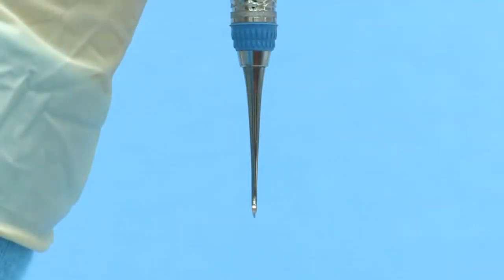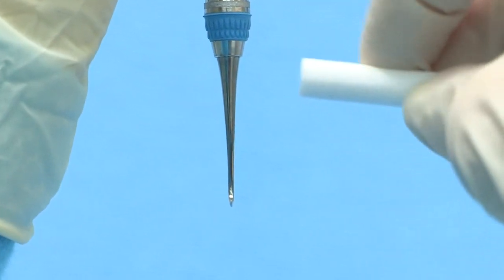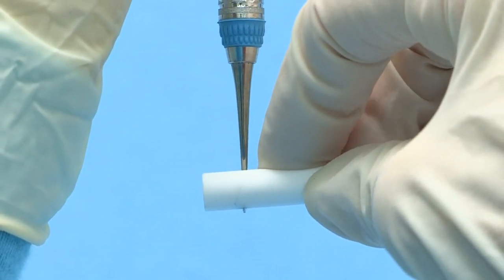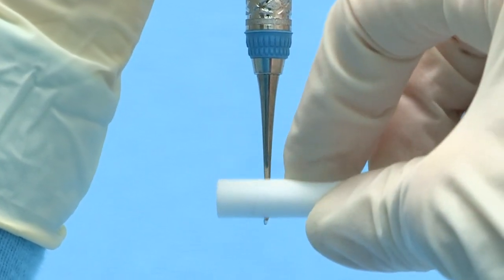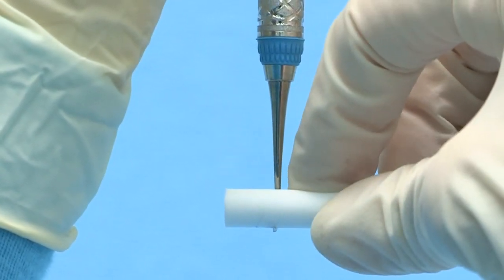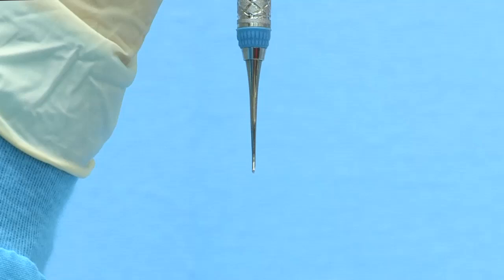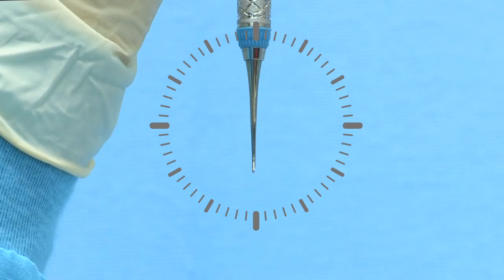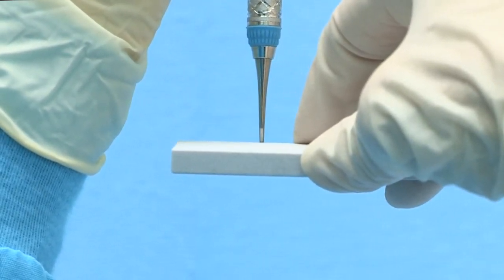To finish sharpening a curved sickle scaler, hold the blade at eye level with the terminal shank positioned at 12 o'clock. Place a cylindrical stone on the face of the blade with the stone positioned horizontally on the facial surface. Lightly roll the cylindrical stone along the face of the blade from the heel to the tip. This will remove any remaining wire edges. To finish sharpening a Jacquette scaler, position the instrument with the terminal shank at 12 o'clock and the tip pointed toward you. Lightly move a flat stone from side to side on the facial surface.